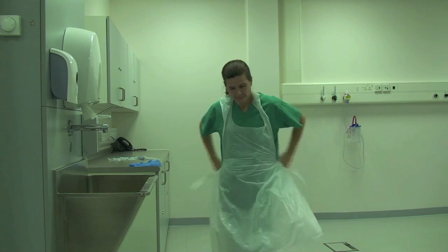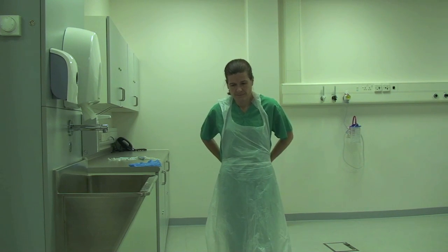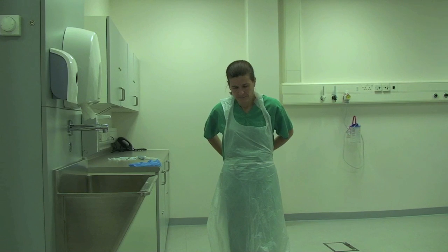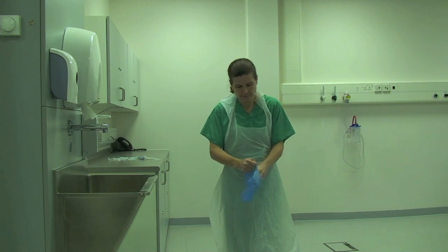First the apron should be placed over the head and tied at the waist. This is followed by a pair of close fitting nitrile gloves.